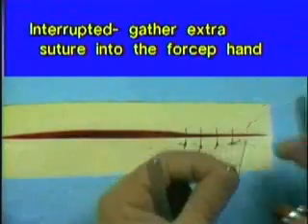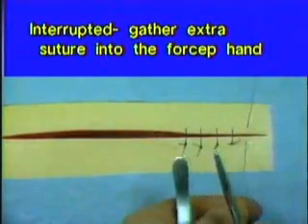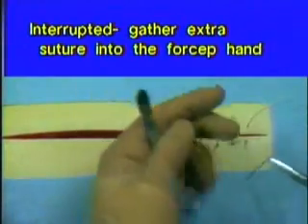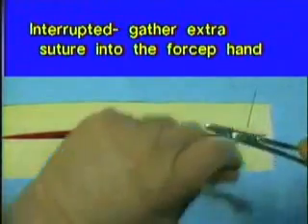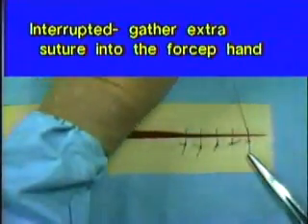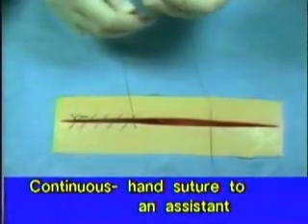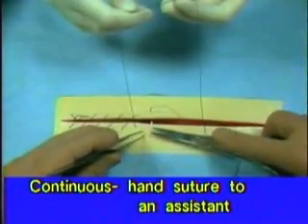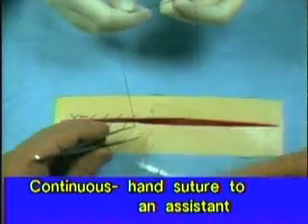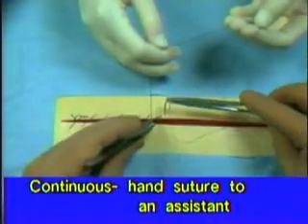You may find it difficult to control long suture ends when tying knots. When an interrupted suture is placed after the needle is extracted, the needle is grasped by the thumb and index fingers, and the remaining suture is pulled and gathered into the available fingers until a workable amount is achieved. On a continuous line, if an assistant is available, once the needle has been extracted, the suture is handed over to the assistant to pull the suture through to the desired length or tension so that the surgeon is ready for the next stitch.